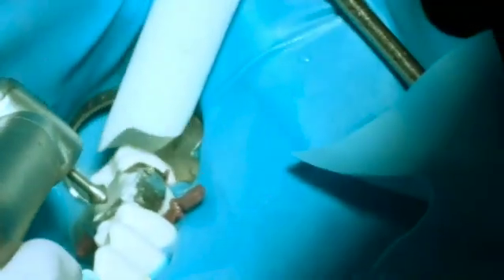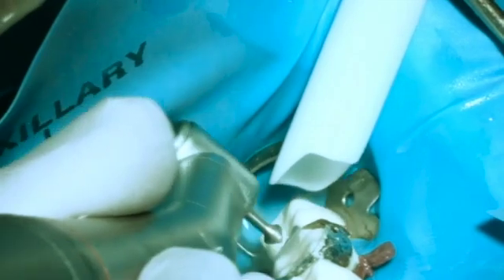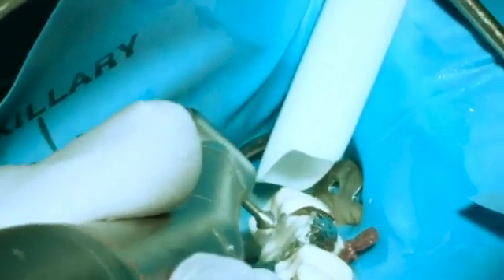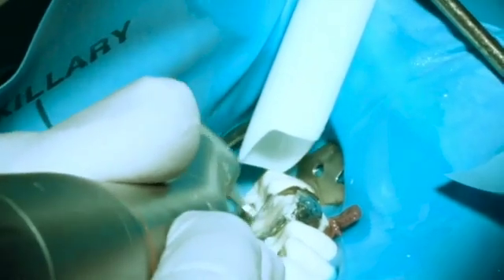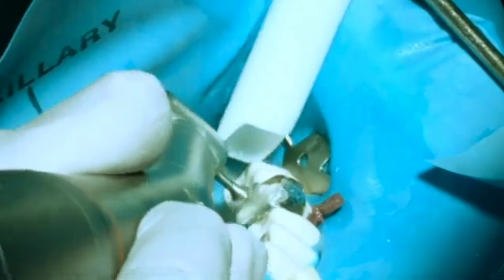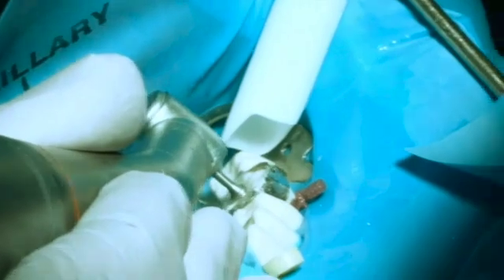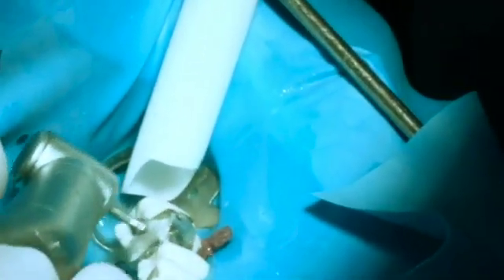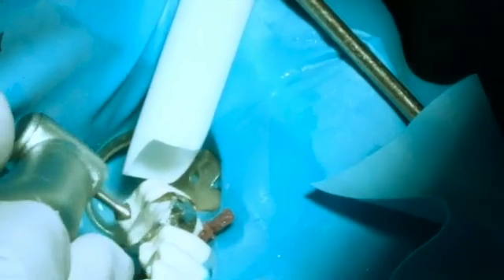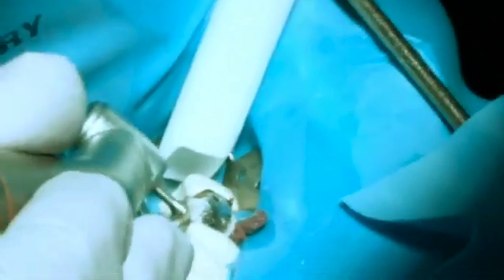Now I'm using the 50-micron medium-sized acorn with the limit stop and the safe edge. The safe edge protects the enamel; the limit stop prevents you from carving too deep. I start in the distal pit or the central pit and go to the next pit halfway, then go to the next pit and bring it back the other halfway, thereby creating planes. These planes define the triangular ridges, the transverse ridge on the upper, and the fifth cusp. It's like automating your hands, making your hands robotic. Look how nicely that forms the planes and how quickly it does it.